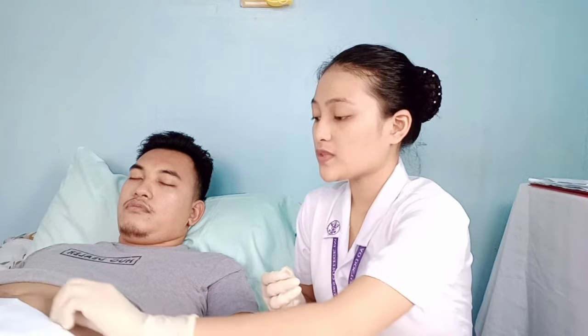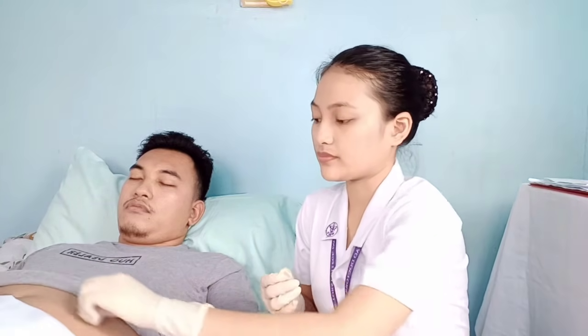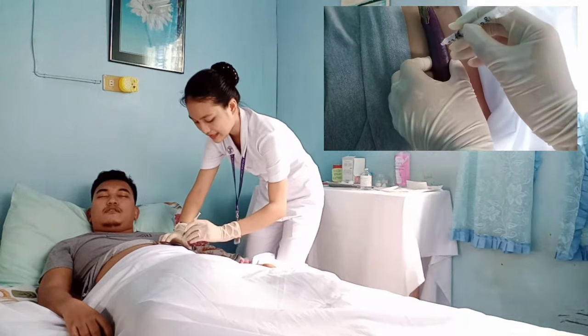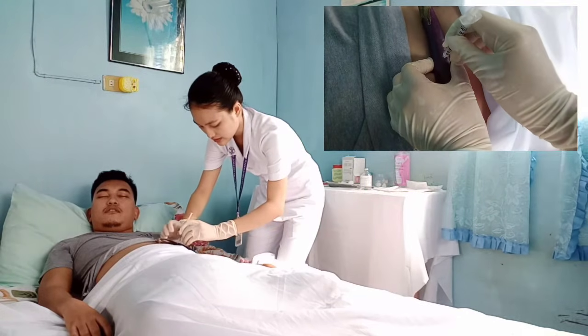Now use an antiseptic swab to clean the site in a circular motion, starting at the center, circling outward. Now pull the needle cap and hold the syringe between the thumb and the forefinger of your dominant hand as if you're holding a dart. Insert the needle quickly and firmly at a 45 to 90 degree angle. Pain is minimized by inserting the needle without hesitation.